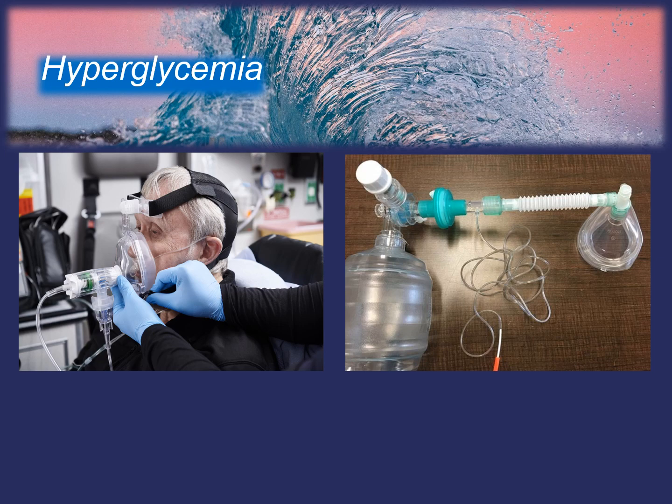Maintaining their intrinsic rate can be accomplished by CPAP, BiPAP, or assisted ventilations with the BVM, with or without an iGel. Some patients may have a well-maintained airway, and application of passive oxygenation with BVM and PEEP will open up the alveoli more to allow for better ventilation.